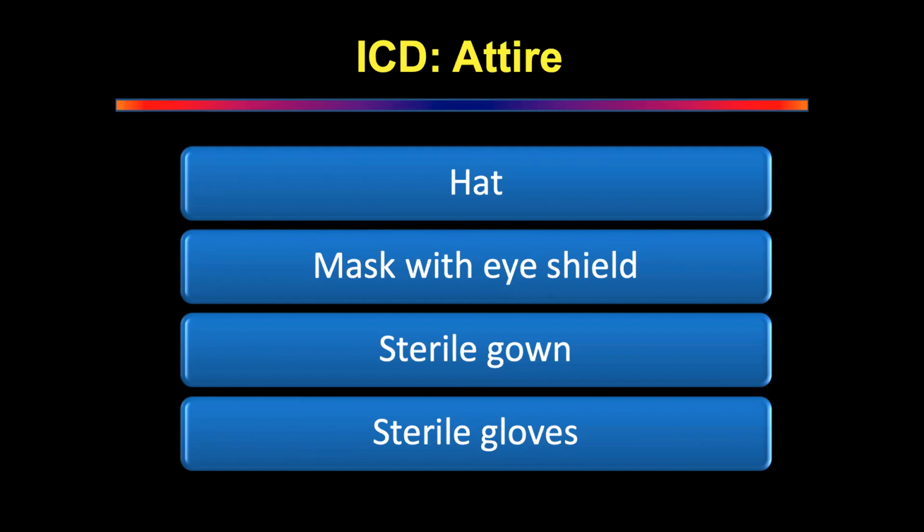Do you understand? My questions are very simple, but they are very relevant. This is what is asked. Unfortunately, people don't come up with eye protection. In COVID-19 scenarios, it is very important to say these things, because you're going to get exposed to intrapleural content. So this is very important.